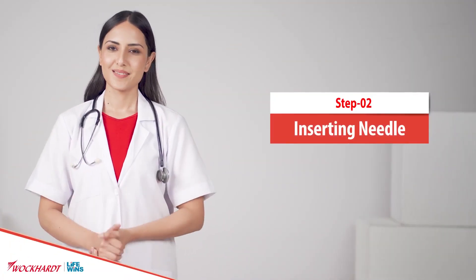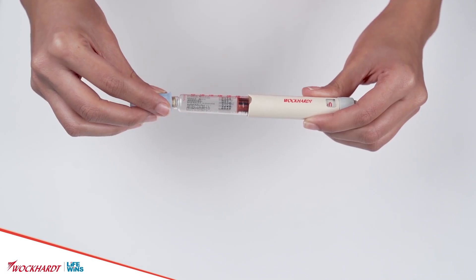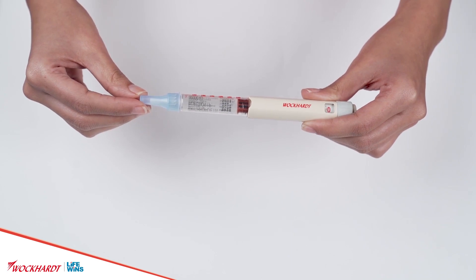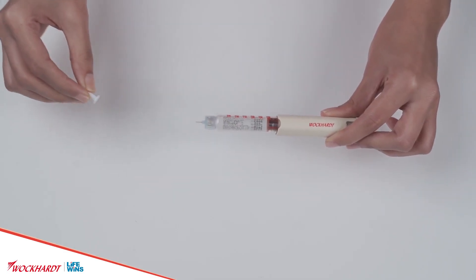Inserting the needle: remove the outer protective flap of the sterile needle and attach it firmly by screwing it into the threads at the tip of the pen cartridge holder. Do not push — screw gently. Remove the outer protective cap along with needle cap from the needle.